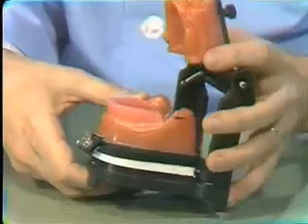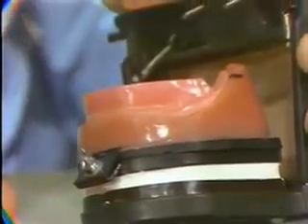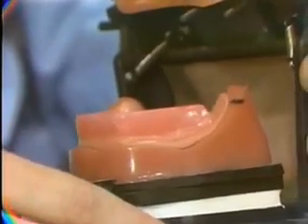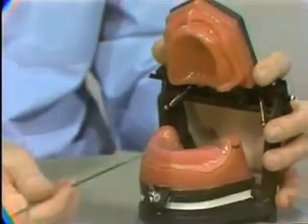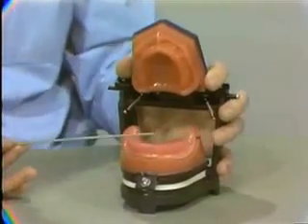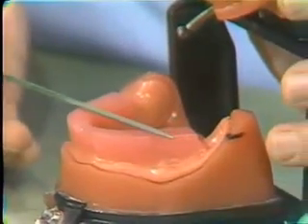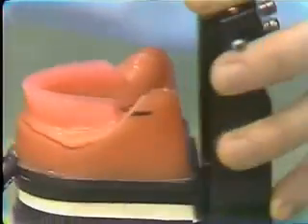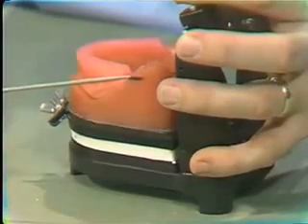Now, what we're looking for, of course, is that the rim is parallel when the unit is on the table, in this case. Okay? Set the instrument on the table and sight both directions. Sight in from the anterior region and sight across laterally, and adapt or make any changes necessary so that the entire surface is parallel. Now, another thing we have to look at is the height. And before, remember, as a guideline, we come about halfway down the retromolar pad and establish that as the height.